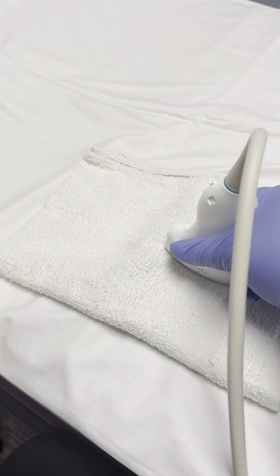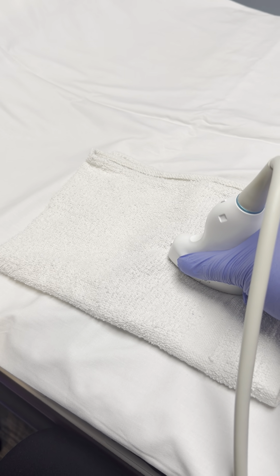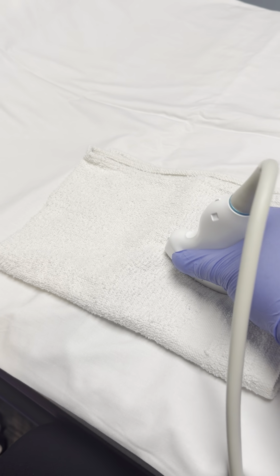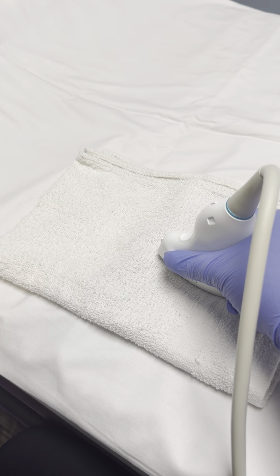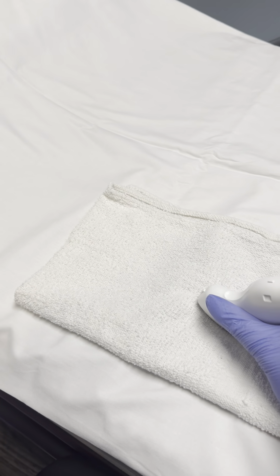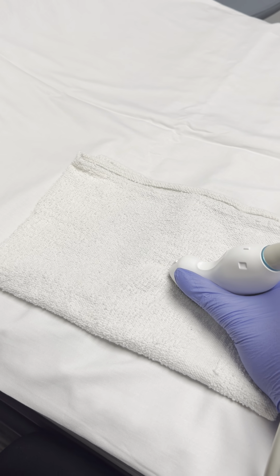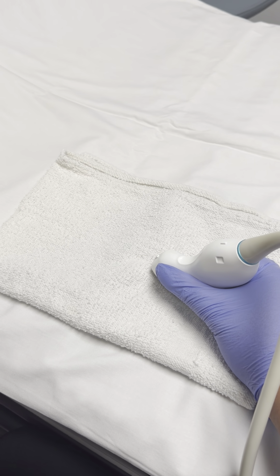Now to go further into the IVC, remember to extend it into the liver, and that's where you practice more of that heel toe maneuver. All right, so it's just to give you the concept. It's much easier as you're scanning to see the direction and so forth. And so I just wanted to give you a brief overview of that.